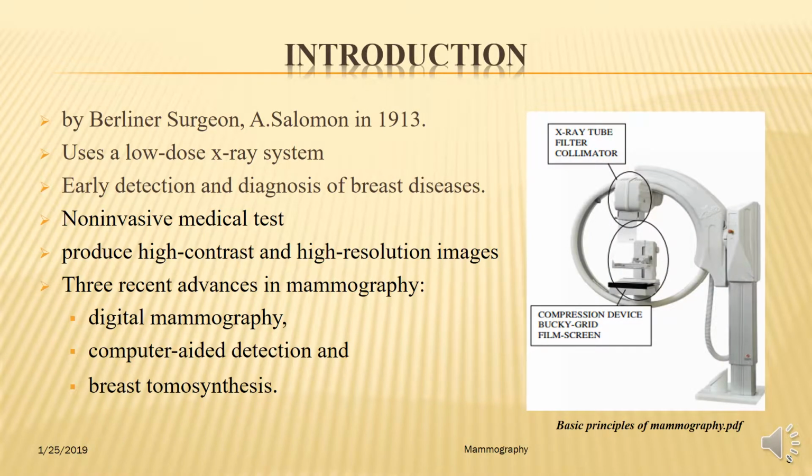Mammography is a specific type of breast imaging that uses low-dose X-ray to detect cancer early, before a woman experiences symptoms, when it is most treatable. It's also a specialized medical imaging device that uses a low-dose X-ray system. A mammography exam is called a mammogram, which aids in the early detection and diagnosis of breast disease in women. It was first invented by the Berlin surgeon Salomon in 1913.